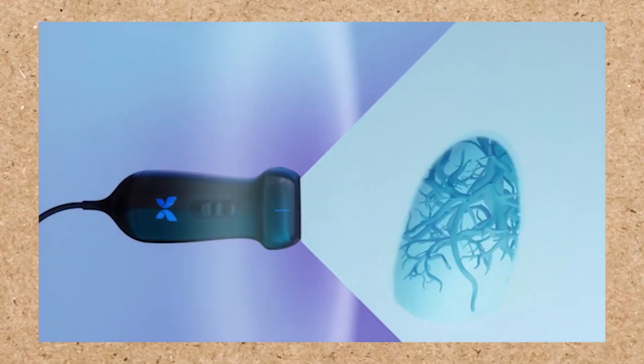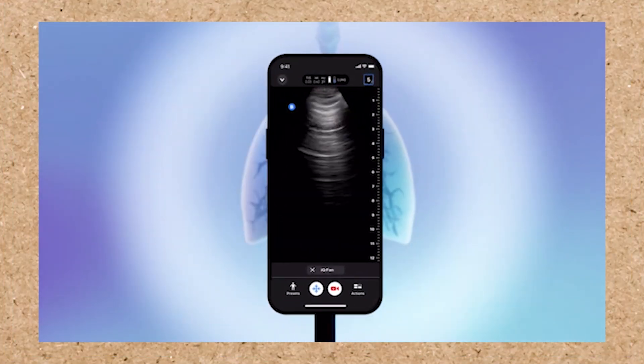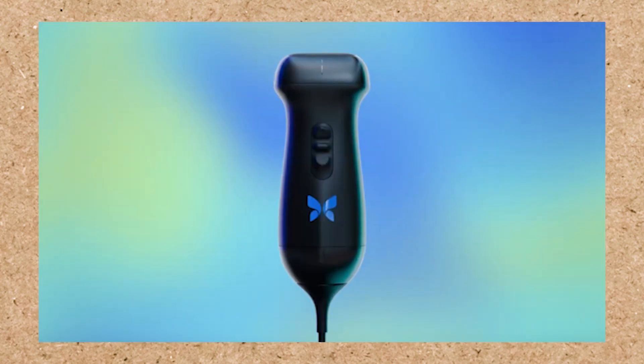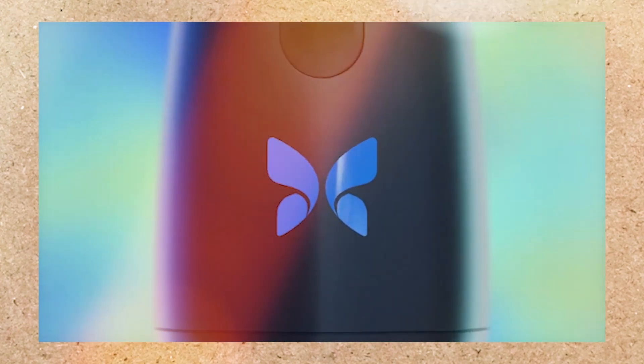Butterfly, the pioneer in handheld ultrasound. They have been in the market for many, many years, and they are continuing to evolve their technology to keep up with the times. We're going to be showing you all the unique features of the Butterfly IQ3 in this episode of Henry Schein Unboxed. Let's check it out.